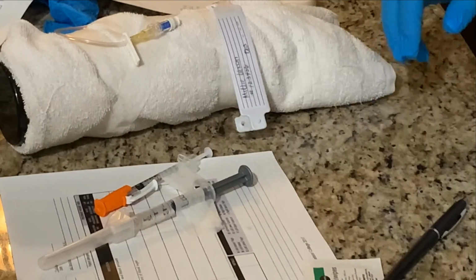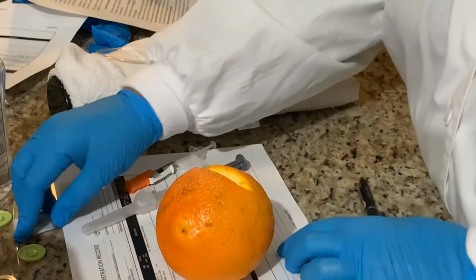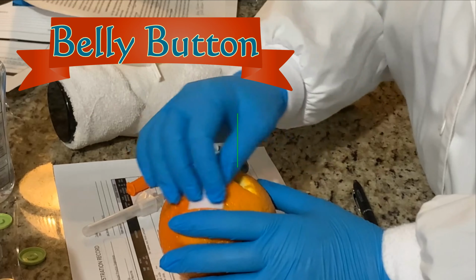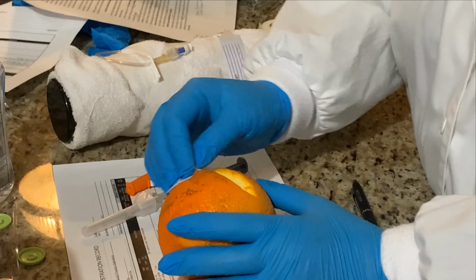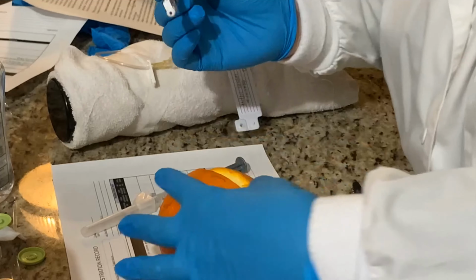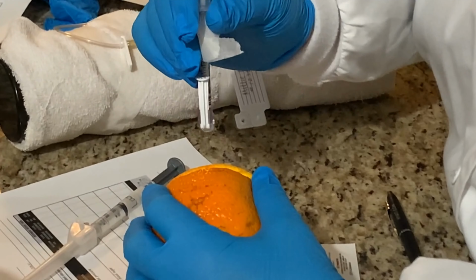Okay, so let's do your sub-Q injection first, Millie. So I'm going to get a new alcohol swab, and I'm giving this to her 2 inches away from her umbilicus, in her belly, in the lower right quadrant of her abdomen. I've explained that to her. Take my needle off. And I'm going to pinch the skin. So I'm pinching the skin. Okay, Millie, you're going to feel a slight stick.